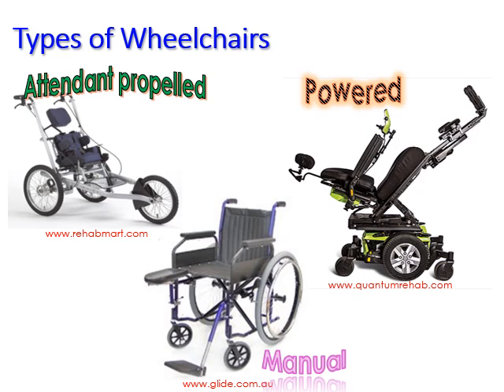The wheelchair you're looking at on the right is called a tilt in space chair, and as I mentioned, it provides pressure relief. There are also chairs used for sports and recreation. There are bariatric wheelchairs, meaning they are for oversized adults, not standard frame wheelchairs but larger wheelchairs, and we call those bariatric chairs.